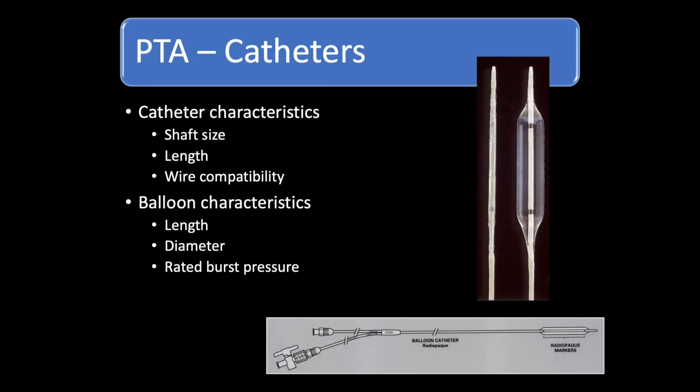Another one is drainage techniques. These three techniques only. Then other things which are there are tissue interventions, where you can take biopsies and other things, sampling techniques, different things. So here, PTA catheters, mainly what you use in PTA, percutaneous transluminal angioplasty, is PTA catheters.